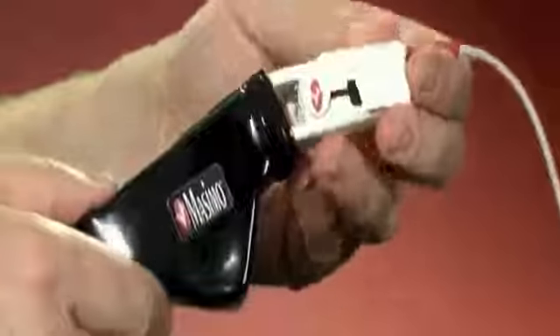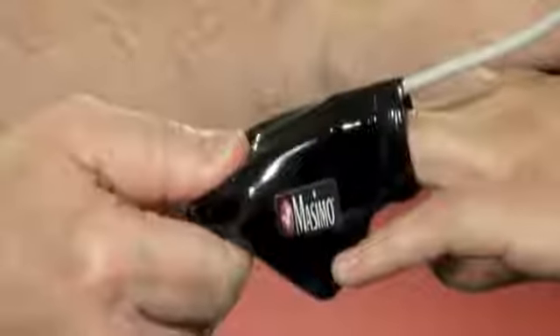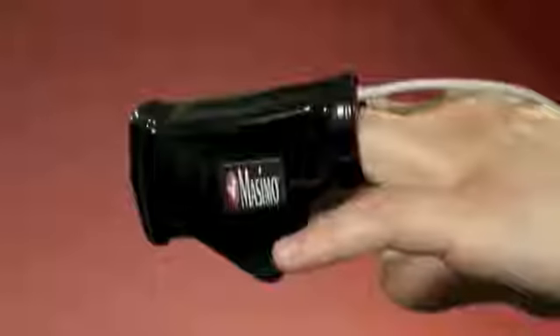If you have elected to use the rubber boot shield, insert the sensor all the way into the light shield prior to placing it on the patient's finger. The cable should run out of the top of the opening. Once the sensor is in the light shield, insert the finger into the sensor, making sure that it is properly aligned and the finger is pushed all the way to the digit stop.